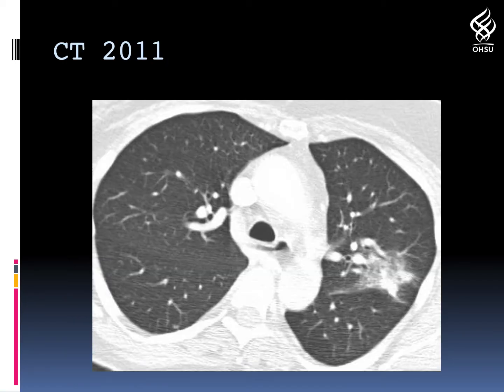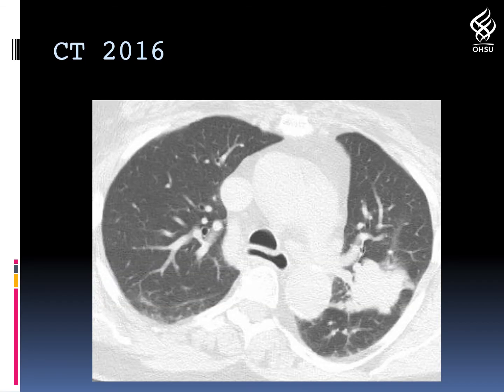Here's the initial CT. We can see a left upper lobe mass, predominantly ground glass, with irregular shaped margins. In 2016, that very same mass had become much more dense. The margins had become much more nodular and lobular, and this was, in fact, an invasive adenocarcinoma.